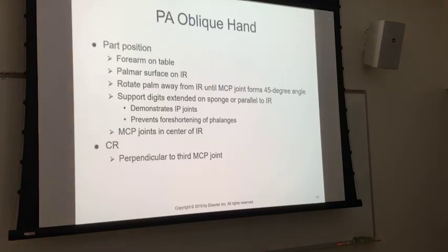So if we're interested in seeing fractures in the phalanges, what we need to do is, again, go to our OK sign, and have the patient resist the urge to really go, okay. They don't need to be mashing their fingers together. Just get them to make a lazy OK sign and fan their fingers out. So fan lateral, good for fractures. Extension, good for foreign bodies.